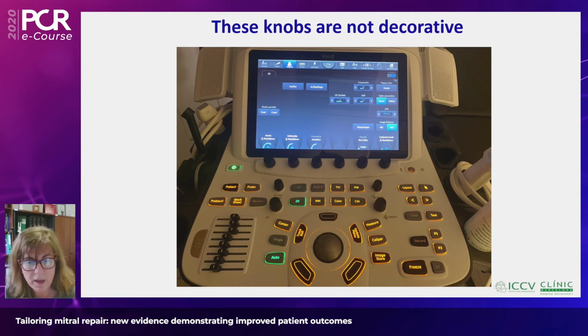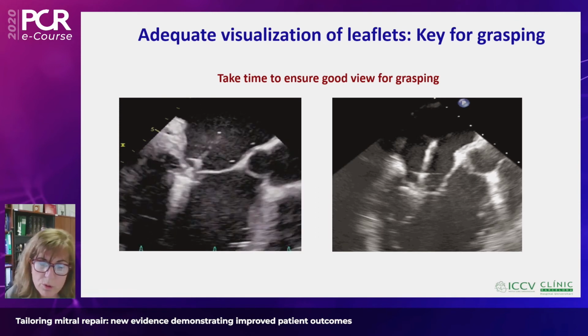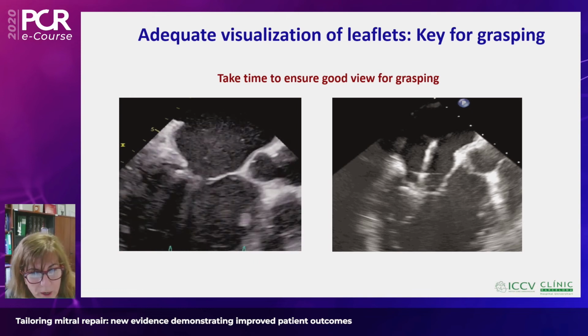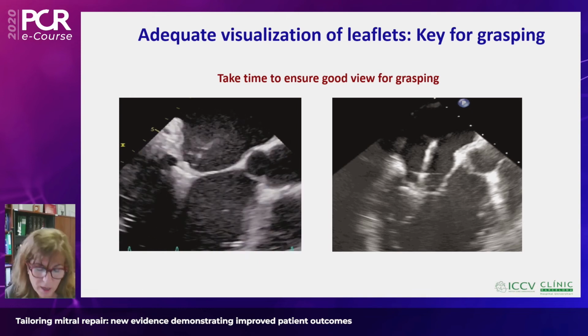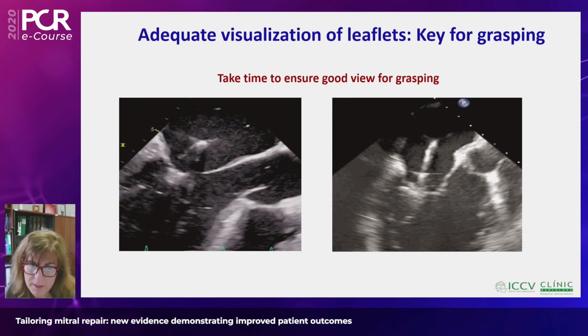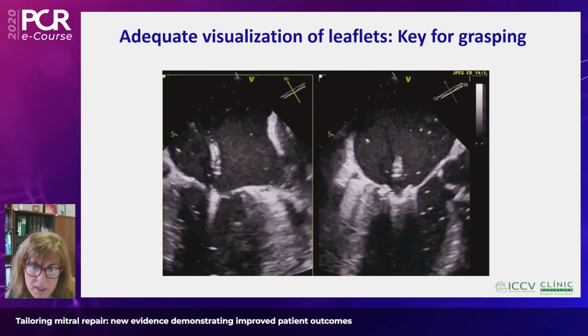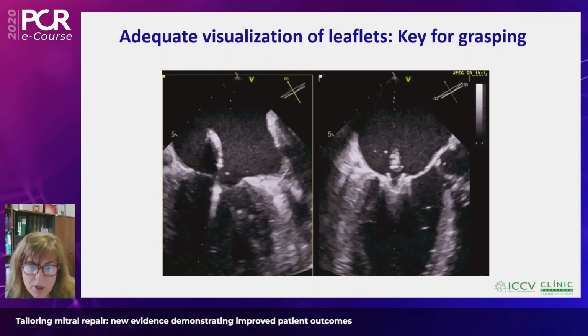So it's not only the hands of the echocardiographer that can improve the image quality, but also playing with these buttons can make an important, a needed change to better visualize the leaflets. And that's important for selection of the patient, as we have said before, but it's really critical when we go to grasp and capture the leaflets. Why? Because we really need to see the leaflets laying on the arms of the device, and we really want to avoid losing one of the leaflets. It's very important to have a perfect image like we have here, where we can even see the leaflets inside the grippers and the arms of the device.